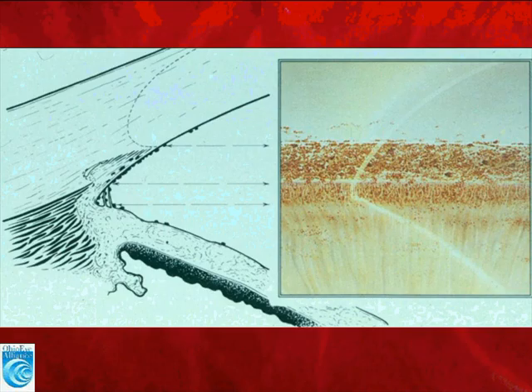Here's a photograph of a patient with pseudoexfoliation syndrome and a Sampaolesi line, and we see something very similar to what we saw in the previous diagram and drawing. In this case, we have diffuse, rather dense pigmentation all across the trabecular meshwork, crossing over scleral spur into ciliary body, crossing over Schwalbe's line, and there is a faint Sampaolesi line as well.